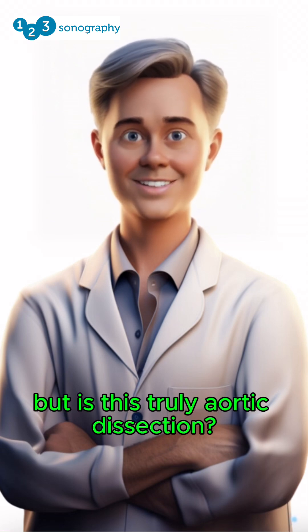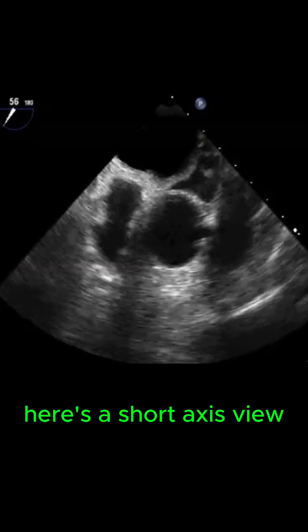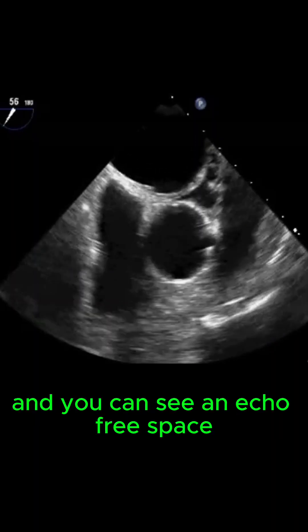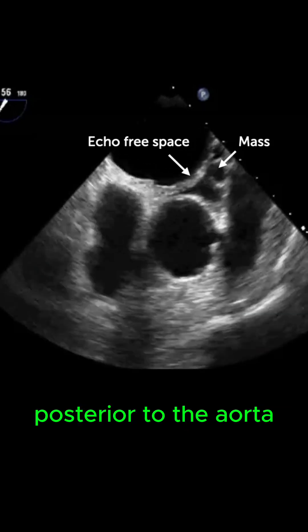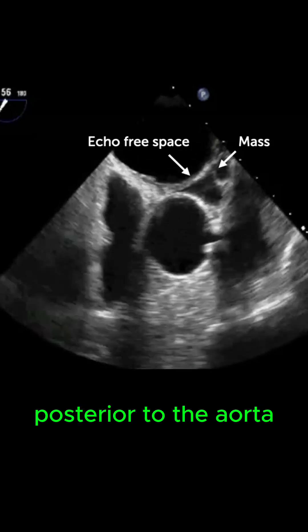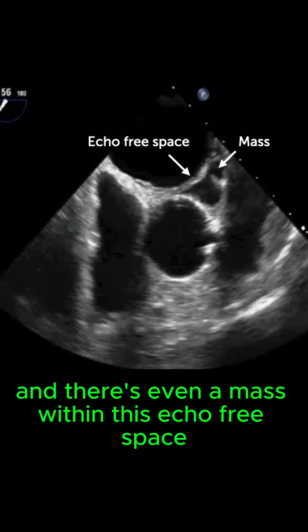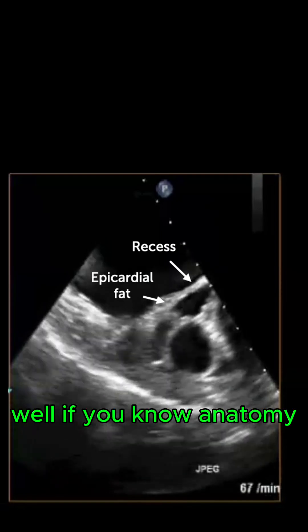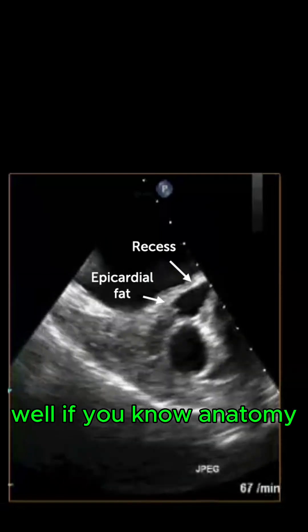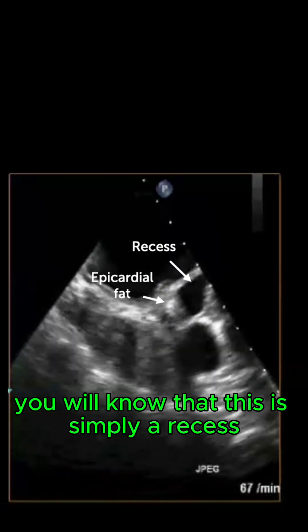But is this truly aortic dissection? Here is a short axis view and you can see an echo-free space posterior to the aorta, and there's even a mass within this echo-free space. Well, if you know anatomy, you will know that this is simply a recess.